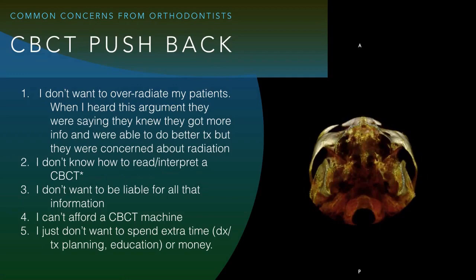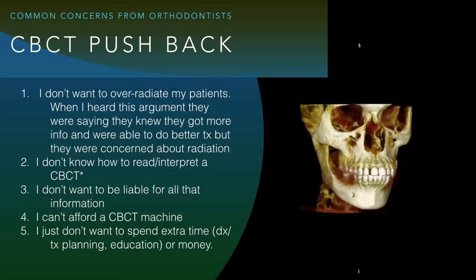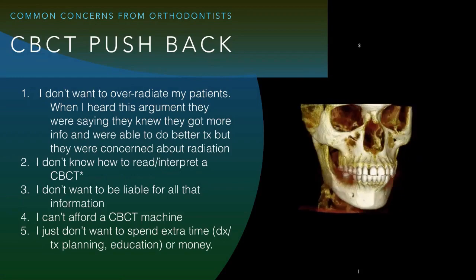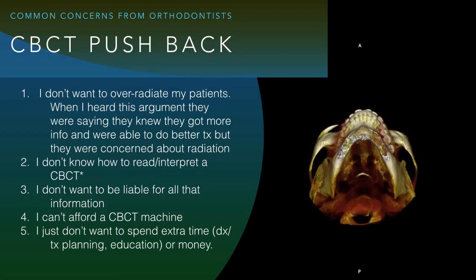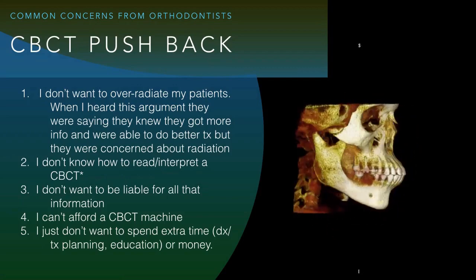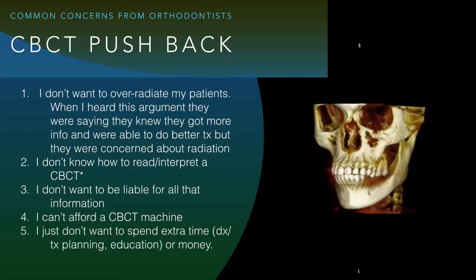I think that's probably one of the biggest and most valid concerns that orthodontists have. The third one, I don't want to be liable for all that information. You're liable for all that information regardless of whether you take a CBCT. I feel like I'm more likely to catch something using CBCT than I would have caught otherwise. And I'm going to be held to that standard of care if ever called to court. And I want all of the information that I can get at my disposal based on what I've been told, when I get there at some point in the future.